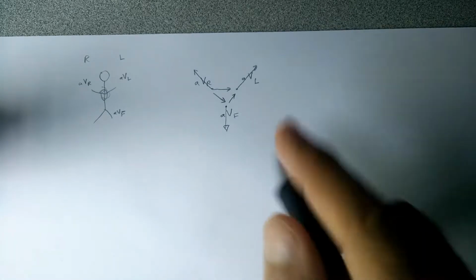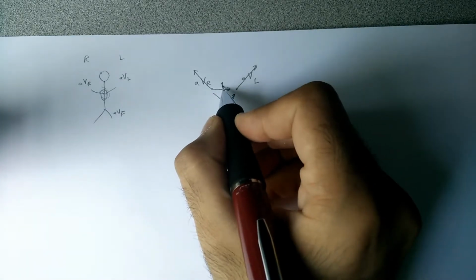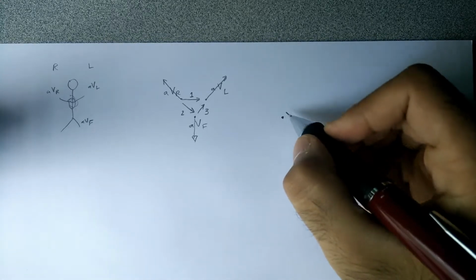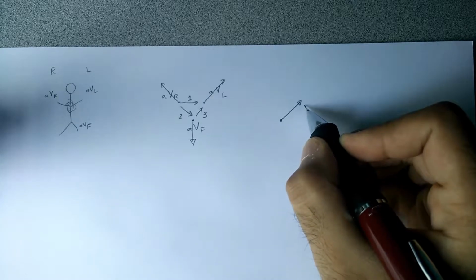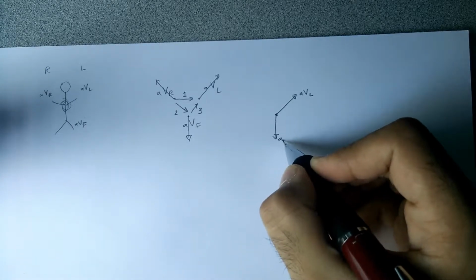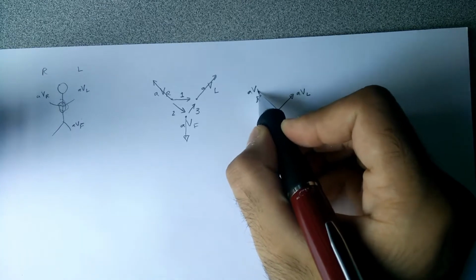Now let's redraw this in a slightly different manner, starting from a center. We start in the center, and we're going to call this lead 1, this lead 2, and this lead 3. If we redraw that, starting at a center point, we'll start with our AVL. AVL is going in this direction. We can draw AV foot, which is straight down. And we can draw AVR, which is going this way, just like we talked about here. We'll call this AVR.